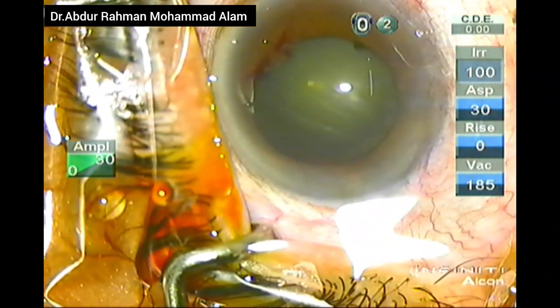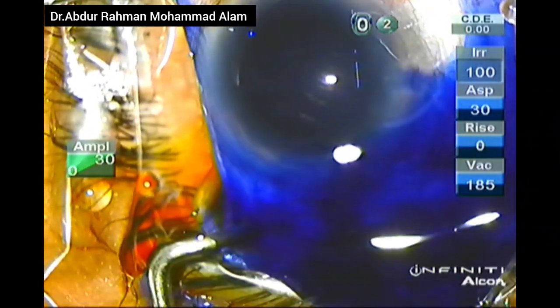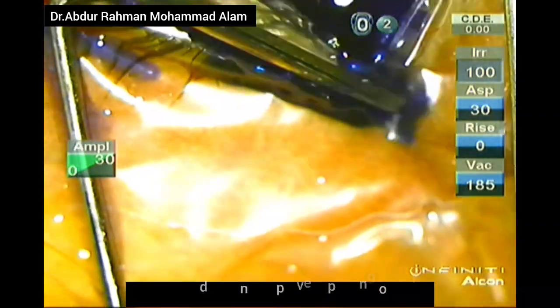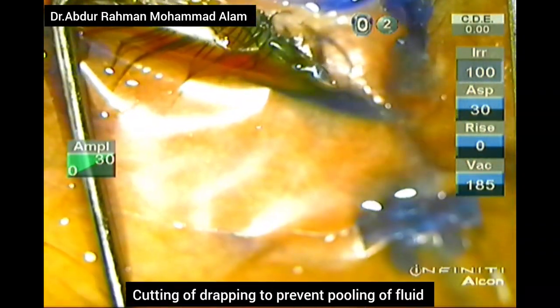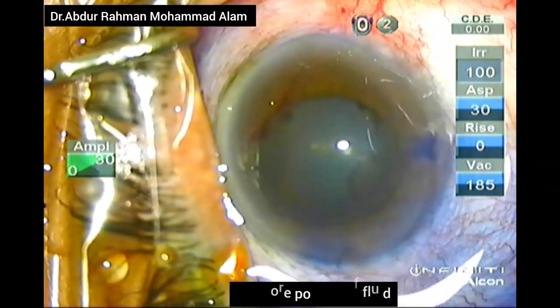Care should be taken not to injure the anterior capsule. Then Trypan Blue is used to stain the anterior capsule. There was pooling of the Trypan Blue due to poor draping. I corrected the draping and there is no further pooling of the fluid or Trypan Blue.